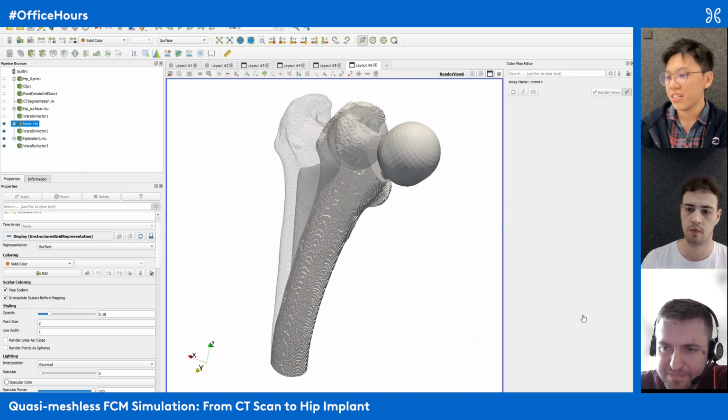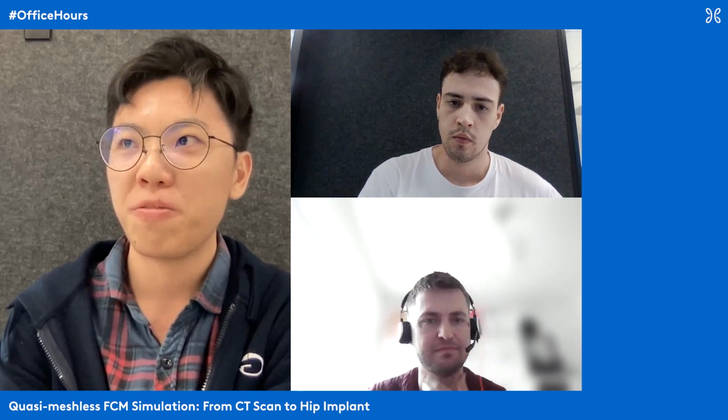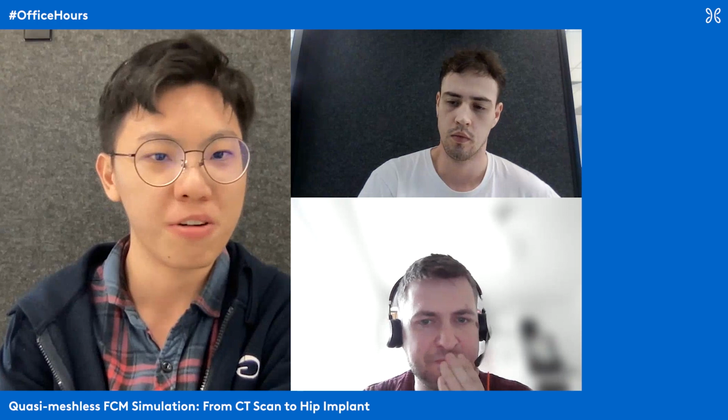And I think one thing that is going to be very interesting for the biomedical engineers out there is that for different designs, different porosities, different lattice structures, the amount of osseointegration and how the bone cells interact with your implant is also going to matter a lot. So this kind of parametric design where you are able to optimize for porosity, for the structure is going to be really beneficial in additive manufacturing.